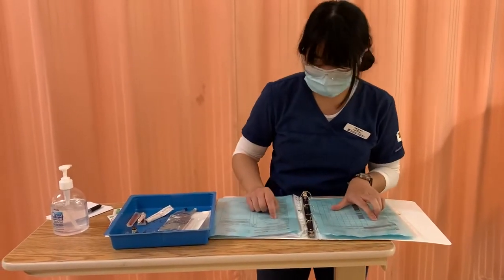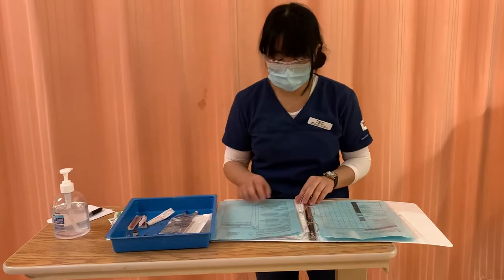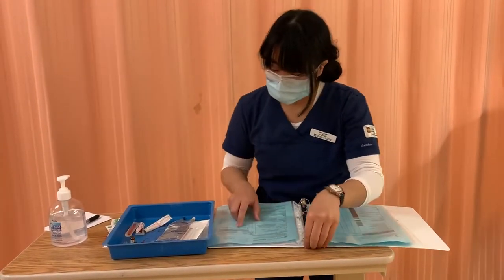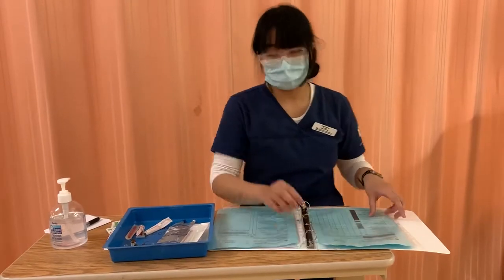Lockout interval is 5 minutes. It says 5 minutes here, so that's the right time. And it's due now. I also checked that it is signed at the bottom by the doctor. And I also checked the policy for this medication as well.